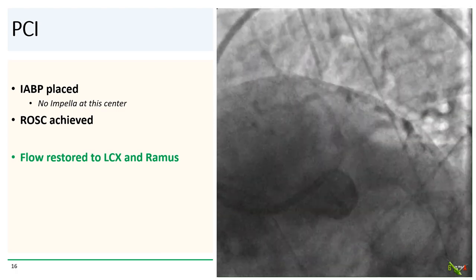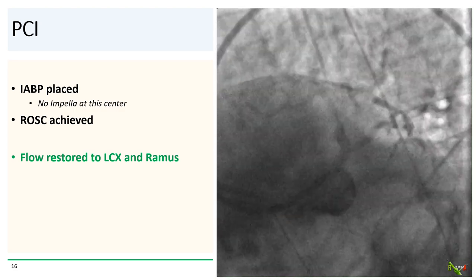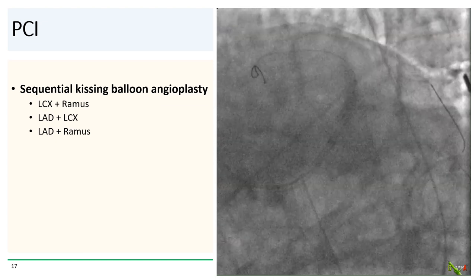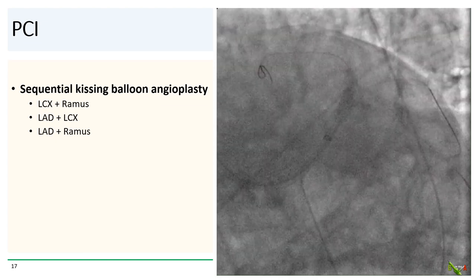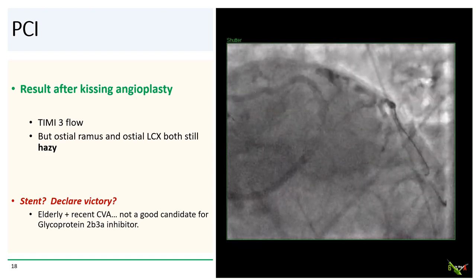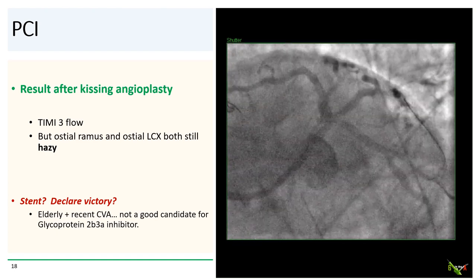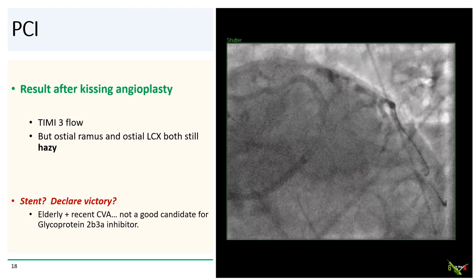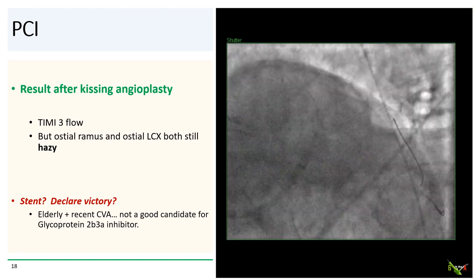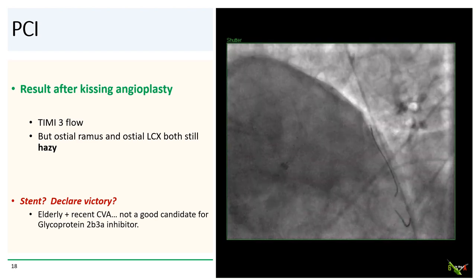Flow was restored to the circ and the ramus. We inserted a balloon pump — Impella was not available at the center. We next did a sequential kissing balloon angioplasty of the circ and ramus, then the LAD and the circ, and then the LAD and the ramus. Here's the angiographic result after kissing angioplasty. We had TIMI-3 flow everywhere, but the ostium of the ramus and the ostium of the circ both still looked somewhat hazy.